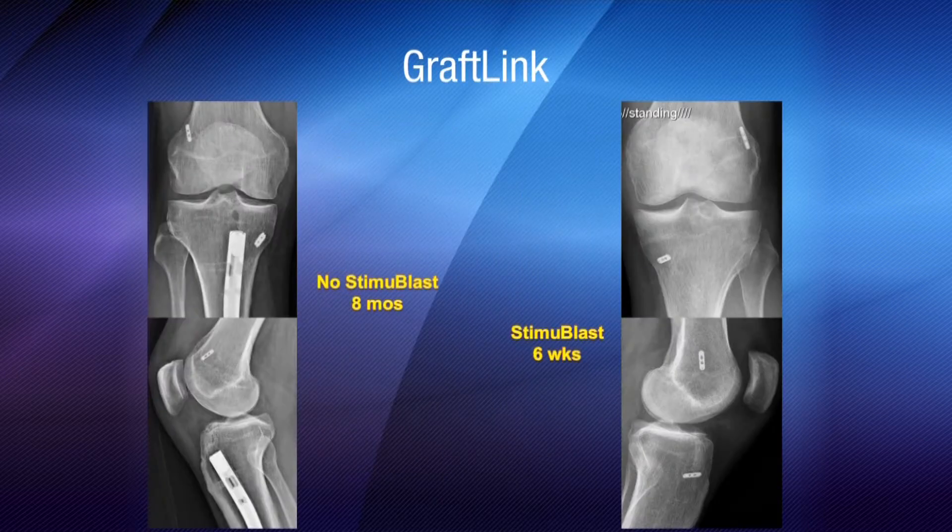In these x-rays, we see that with Graflink when no Stimiblast is used, we see the tunnels very easily. However, with Stimiblast and six weeks out, it's almost impossible to see where the tunnels are.